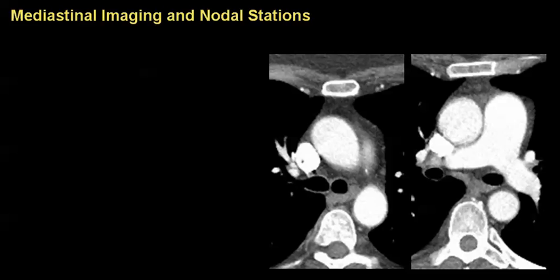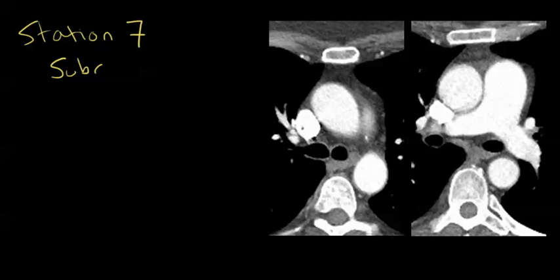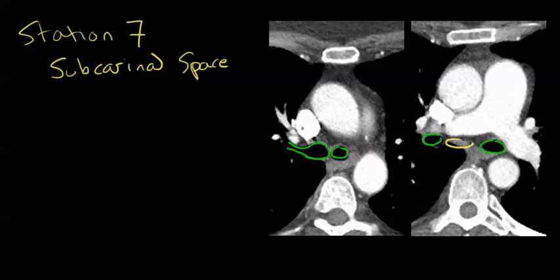Looking at the first two slices of the CT scan, I've focused in on station 7, also known as the subcarinal space. Here you can see the right main stem with the takeoff of the right upper lobe bronchus, and this is the left main stem. Going down a bit, we're now on the bronchus intermedius — the right upper lobe has gone away — and here is still the left main stem. In between here is a level 7 lymph node.